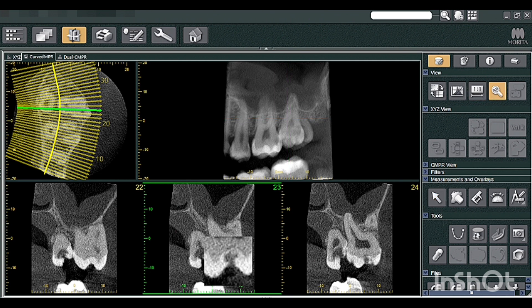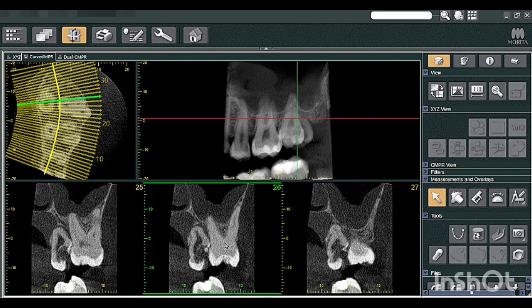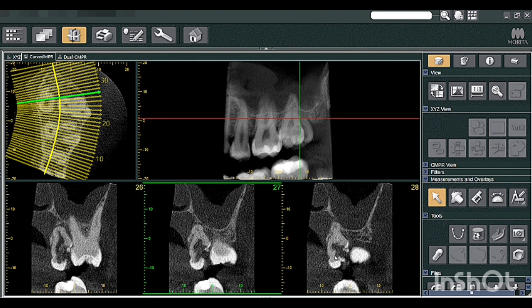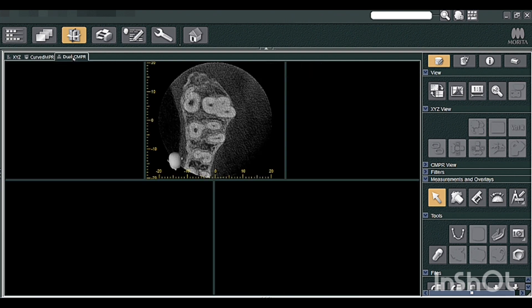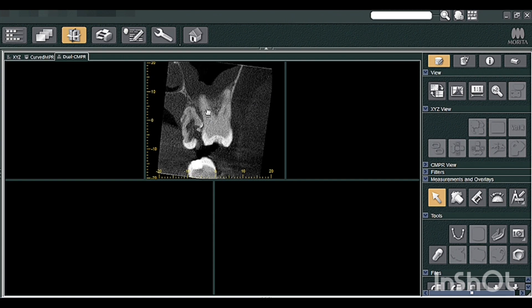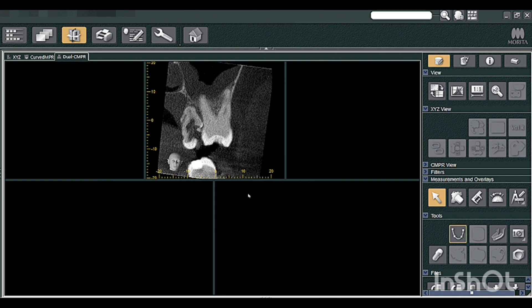You can also see occlusal caries evident in 27. This is the palatal root of 27, the meso-buccal root, and the disto-buccal root. The roots are very long. The palatally placed fused roots of 28 are in contact with the sinus floor. You can study the same thing in the dual CMPR view — you can change the pull direction of viewing either here or in dual CMPR and do the spline marking.